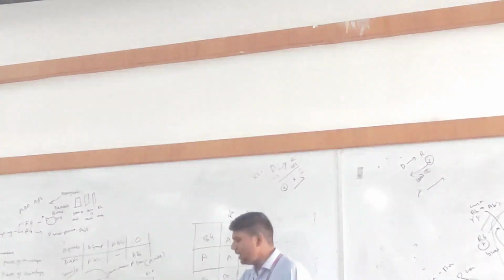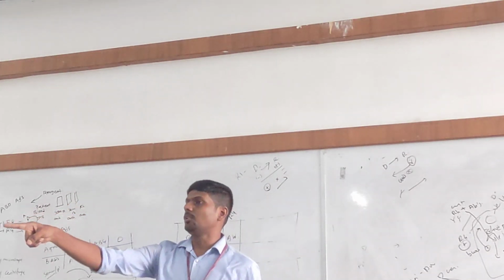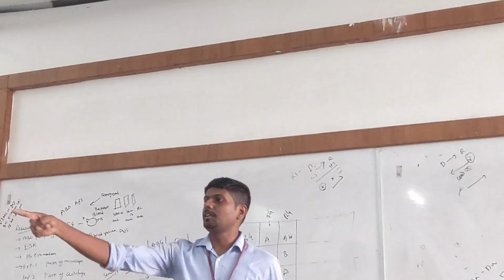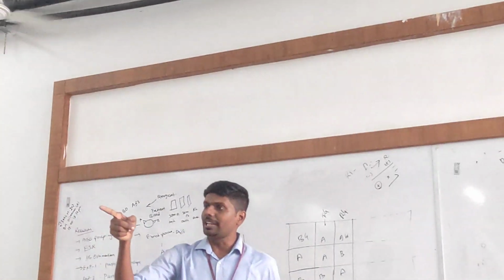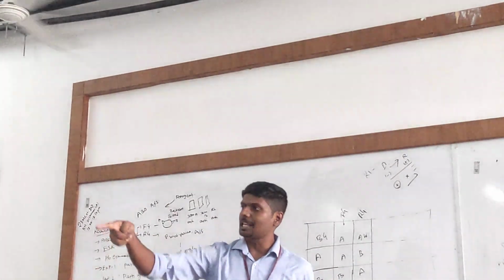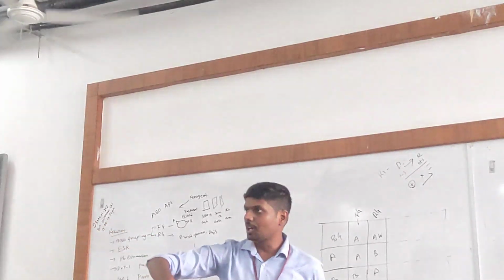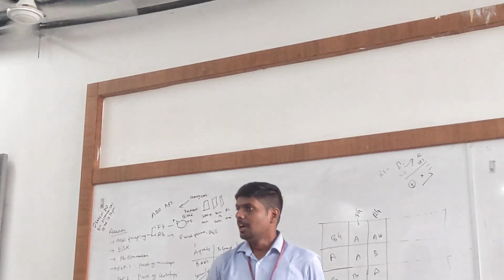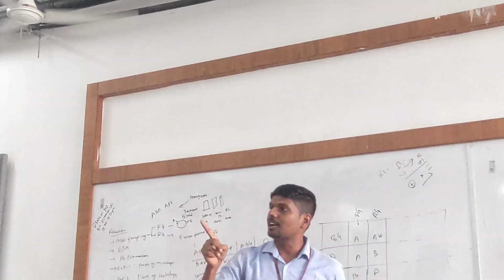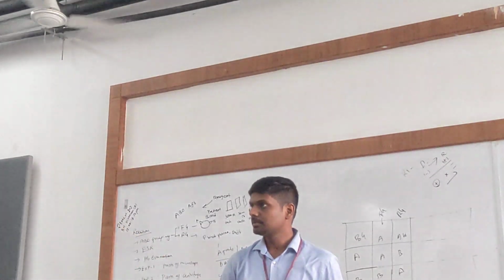If we are not doing reverse grouping, blindly we will think Talan is O negative and Simran is O negative. We can transfuse their blood. But I haven't checked whether Simran has any other antibodies attacking Talan's blood. Because I did only forward grouping, I transfused and Simran collapsed. That's why secondary I need to check her reverse grouping also for both the donor and recipient.